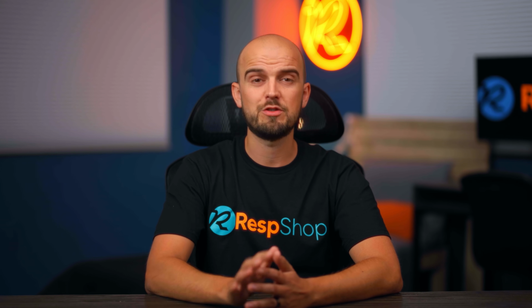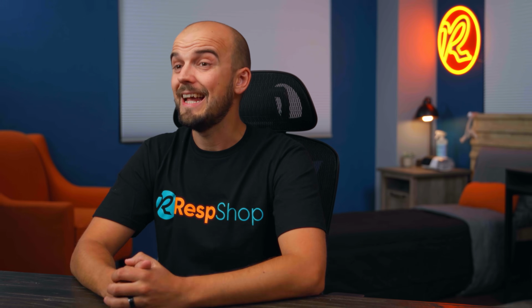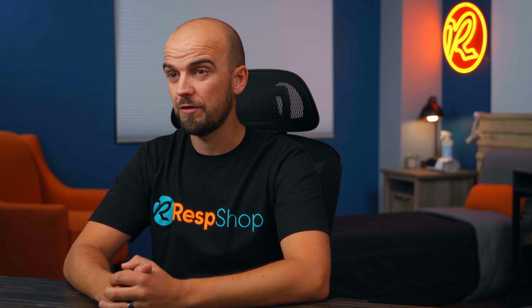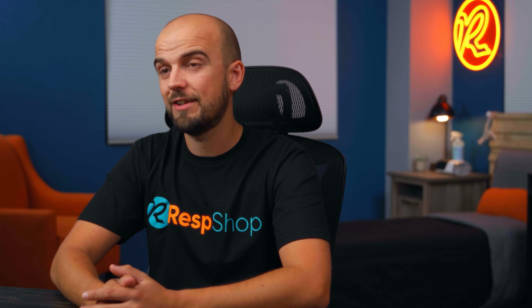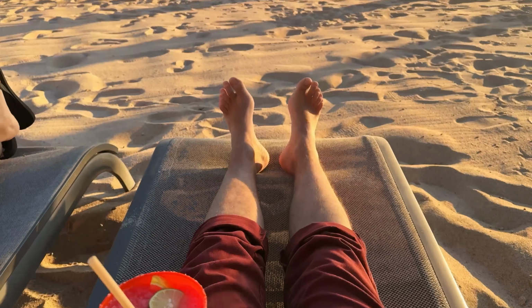But the most important thing to remember, no matter what problem you're having, is keep going. It's difficult for everybody to begin with, but with some perseverance and a little experimentation, you will find a solution that works. And then you can finally get those good nights of sleep that you so desperately need.